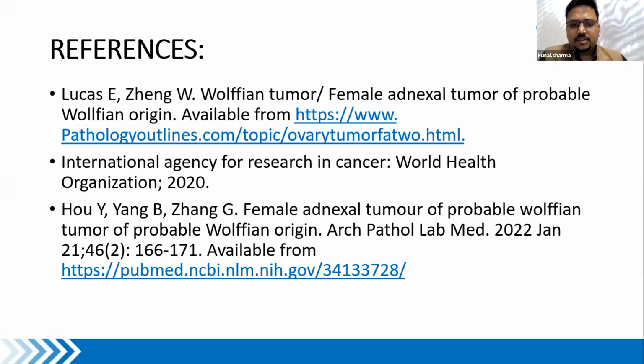Then Dr. Bipasa Chatterjee has asked, did you see mitosis in it? No, madam. Actually, I only saw 0 to 1 mitosis per 10 high power fields, and it was very, very occasional. I had taken 7 to 8 sections, and on extensive searching, I only got 0 to 1 mitosis per 10 high power fields.